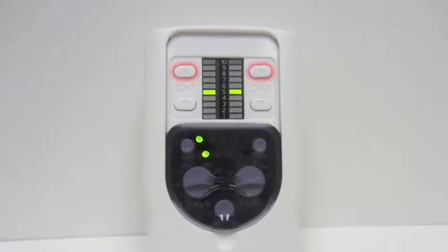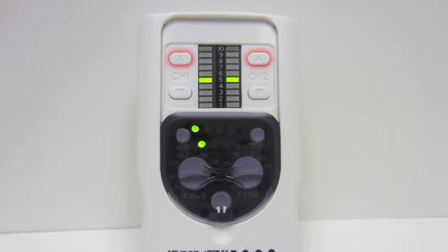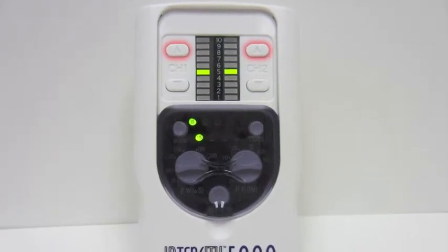Then slide the safety cover down until it locks. This will prevent you from accidentally changing the intensity throughout the course of the treatment. Select the up arrow until you start to feel stimulation, then set it to a comfortable level. Leave it on throughout the course of the treatment, and when you are finished, slide the cover back up and turn the unit off. We want to thank you for coming to Medical Products Online.